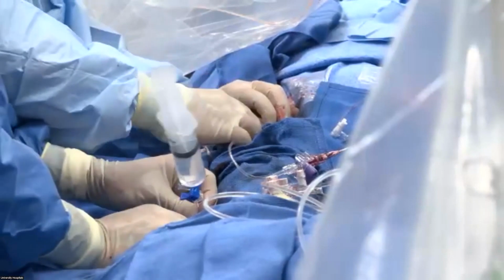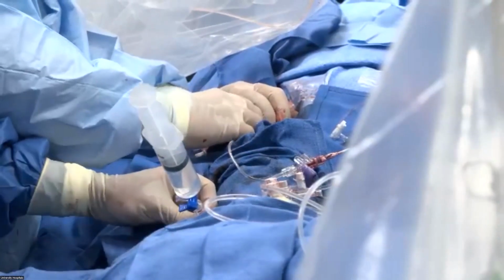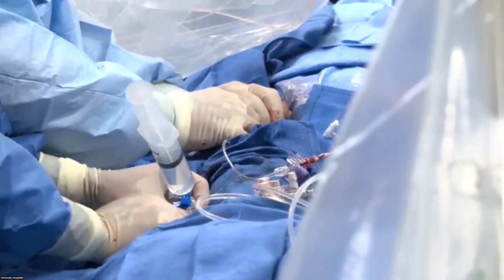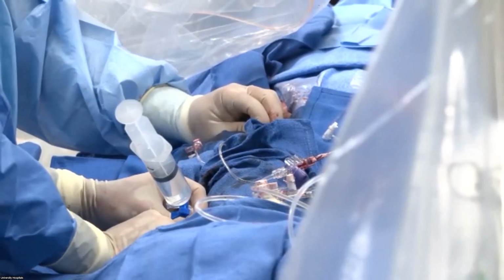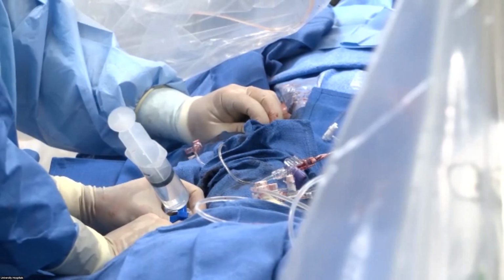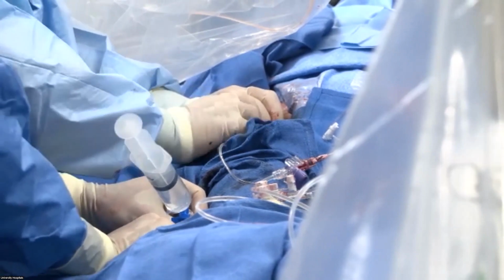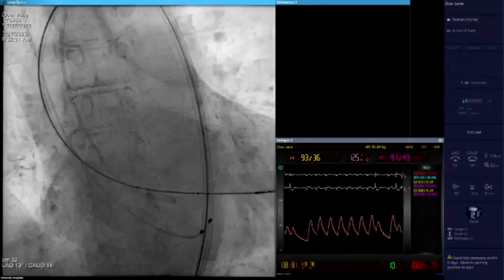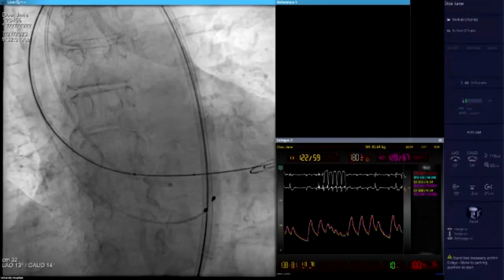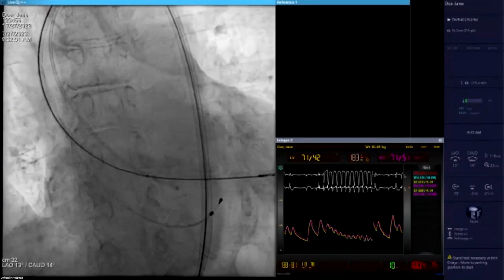Flora? There were some EKG changes. Yeah. So Chris is pointing out here that there is a little EKG change with the wire and with the balloon. Okay. A little more. Okay, who's going to pace? Okay. All right, ready? Pacemaker on and 180. Pacer off.